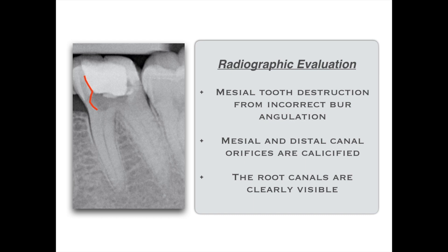Our goal here is to not destroy or destruct any more tooth structure. We will maintain whatever tooth structure is there and only search without destruction on the mesial side. Second, I'm going to look at the calcification. We can see the orifices of both the mesial and distal canals are calcified. I need to negotiate 3 to 4 millimeters into the orifices in order to find the canal and negotiate to the apex. The advantage here is that beyond the calcification the canals are clearly visible in this radiograph.